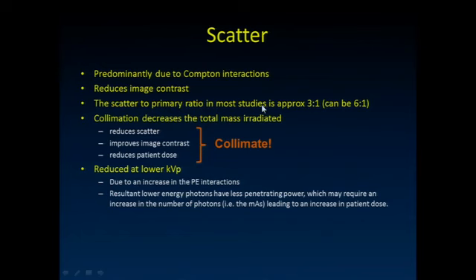I next want to talk a little bit about scatter. You know, we've talked about this really being due predominantly to those Compton interactions.